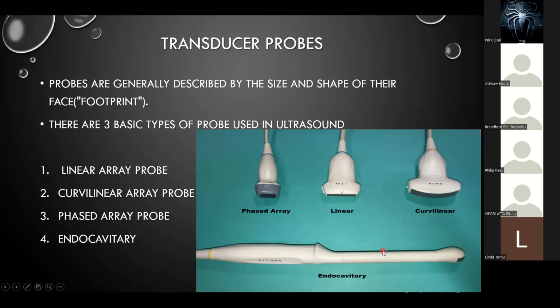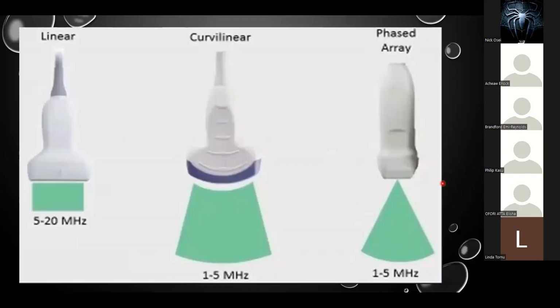You get to learn the applications. This will pick up a pregnancy much earlier than a normal curvilinear scan will do. You get it? All right, so that's one thing I've added that I wanted you to note.